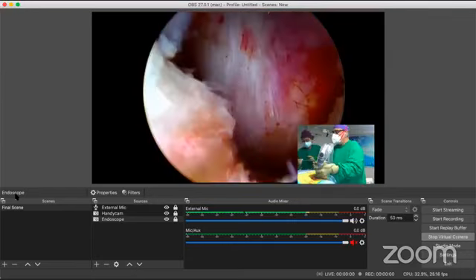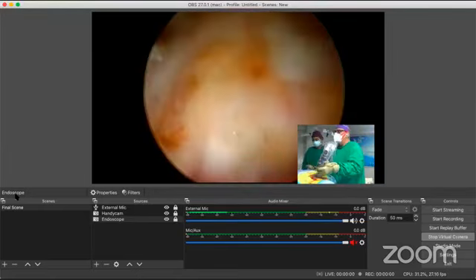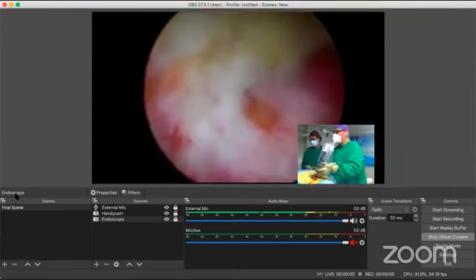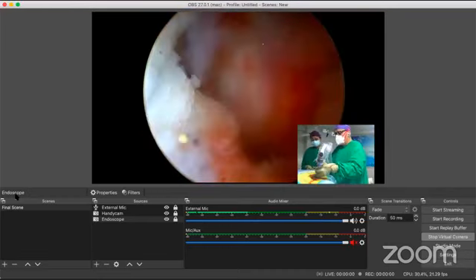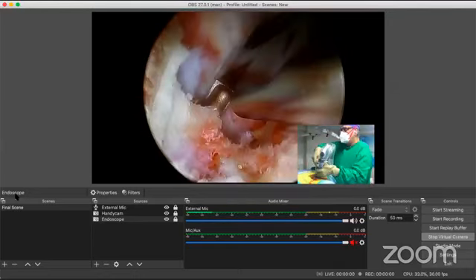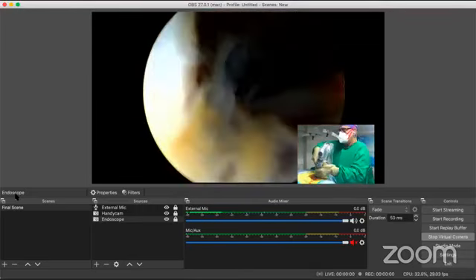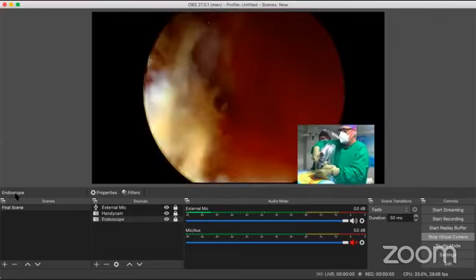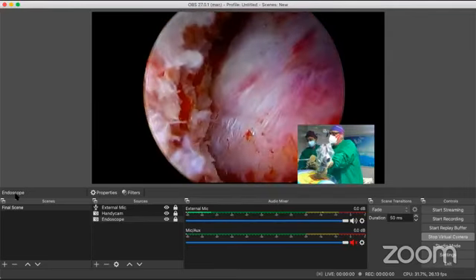I will be cutting this bone a little more now. Okay. And a little more of the central. You can see from here, the whole nerve root starts. The nerve root starts from here, and we have come right across laterally. Okay. We're going to go a little more. You can see the entire nerve root going here beautifully.